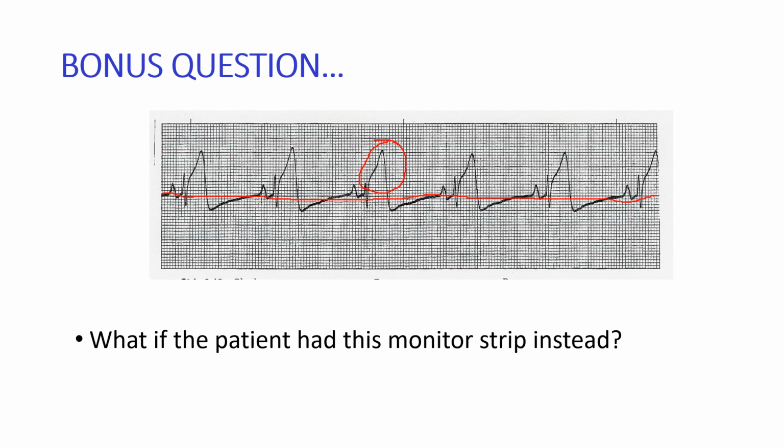One of the things that we want to emphasize is that if you are a monitor tech, you want to note that and alert the nurse right away. And the nurses are going to have to get a 12-lead EKG and probably call a rapid response, check your patient. But that is due to ST elevation, which they could be having a STEMI. And notify your provider.